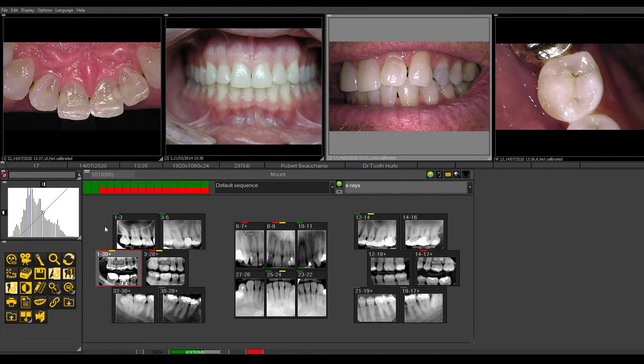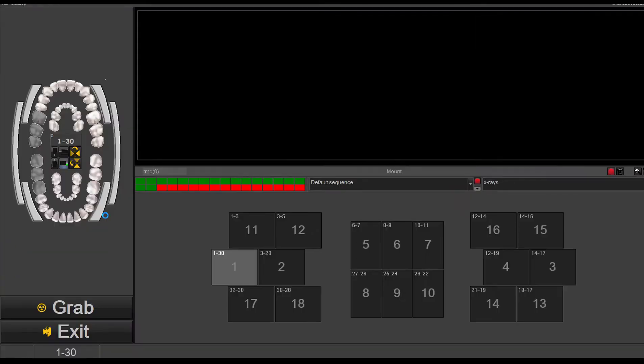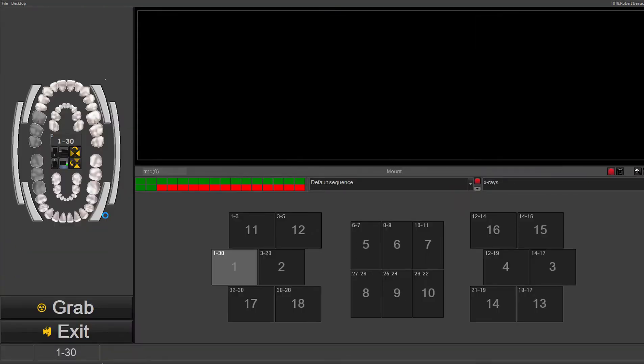If somebody comes into the office and there's an emergency, what you can do is quickly just take a picture, take an x-ray, and launch the x-ray acquisition.